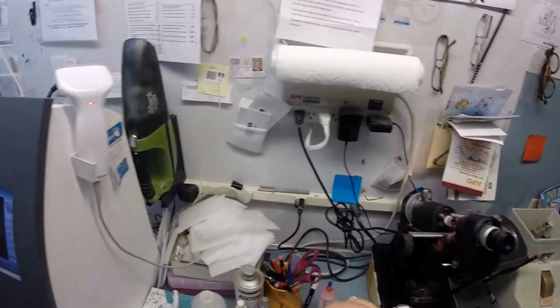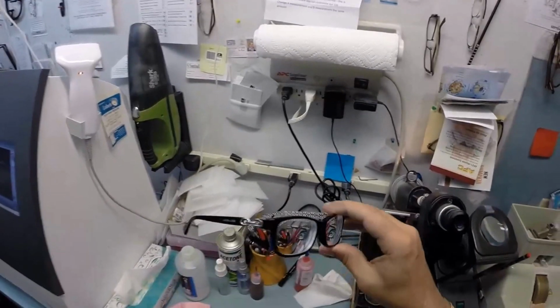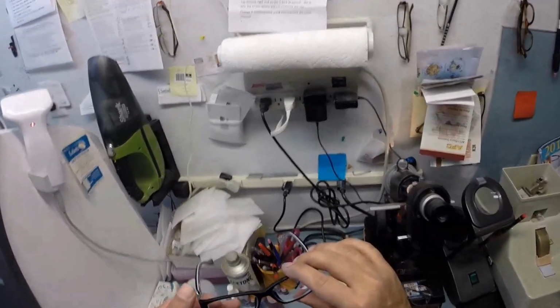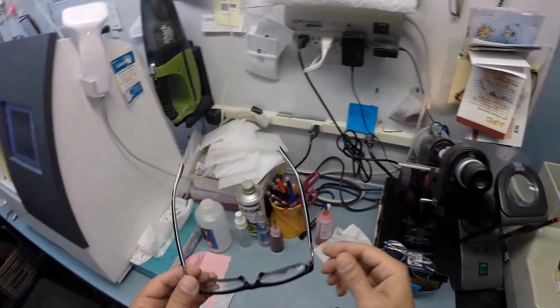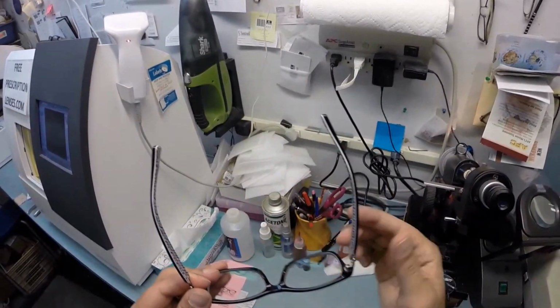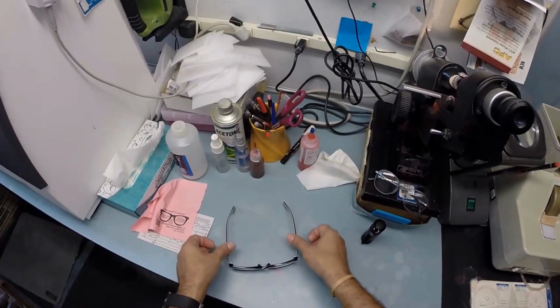But as I said, if these are a little loose or a little tight, just stop by your own optical shop in a town near you, and it only takes about 30 seconds to a minute to adjust them properly. But I'm going to do that in advance, get them in standard alignment, also known as a 3-point stance. The 3 points are 1, 2, the bottom of the frame being 3. I set them on the counter and press down.